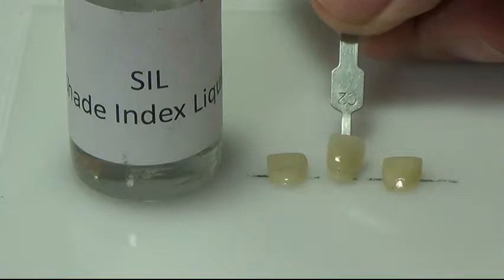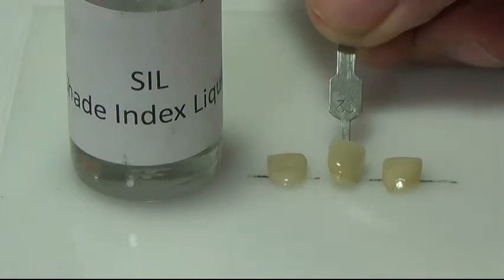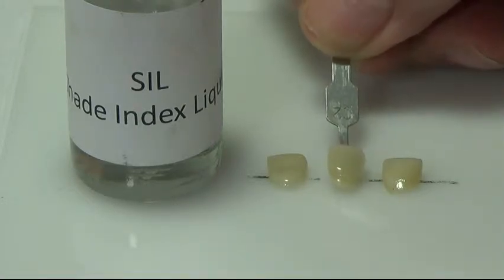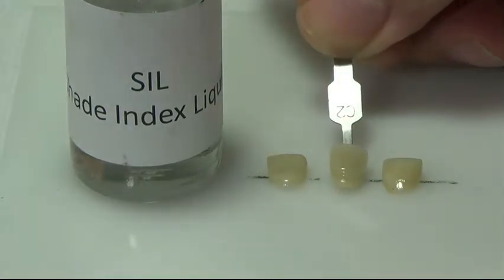What you can expect from these results is a tremendous increase in life-like replication. As a technician, it took me a while to realize it wasn't important to match shade guides — it was important to match teeth and replicate the illumination as close as possible. Your polychromatic shading system will enable you to do this with greater ease.